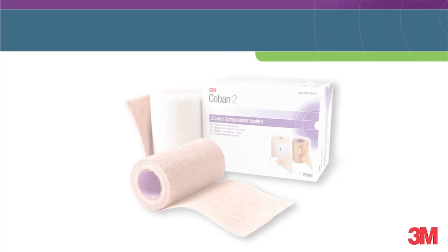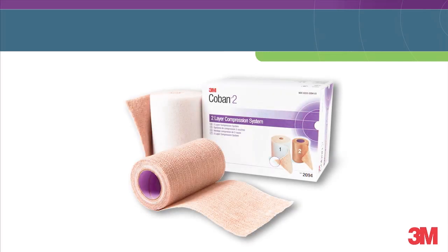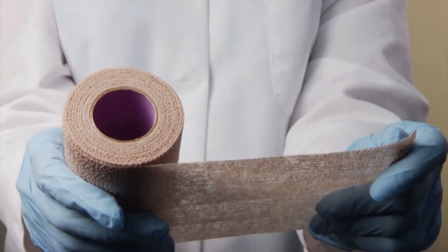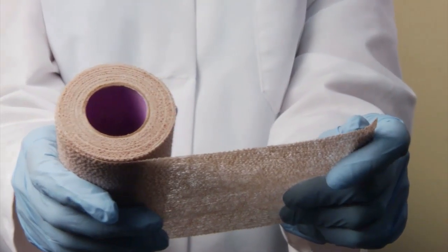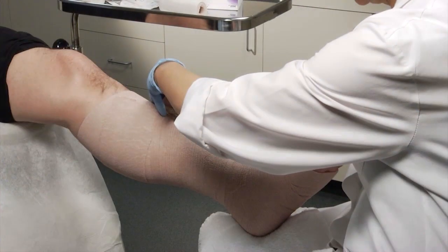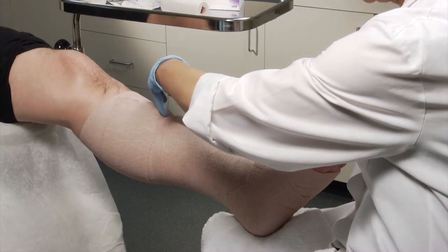Let's begin the demonstration using the cutting technique. For this application I'm using Coban 2 compression system 3M number 2094. If I were using the Coban 2 light compression system 3M number 2794E, the application would be the same. The compression layer of each of these systems has been specifically designed to deliver an effective level of sub-bandage pressure when applied at full stretch. This reduces the guesswork and variability of applications.